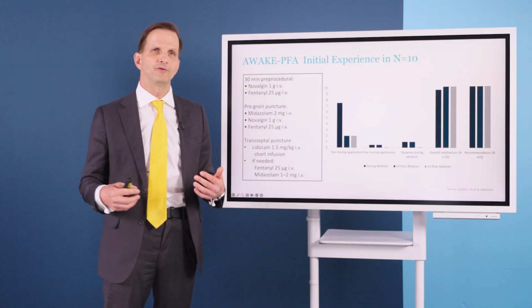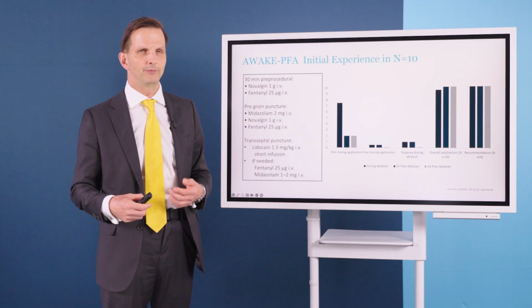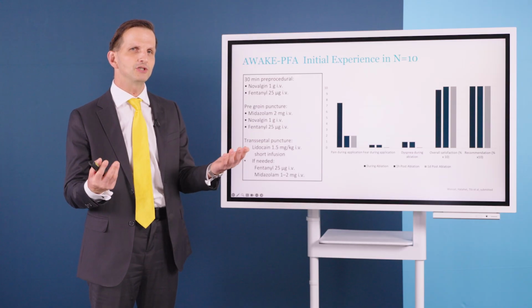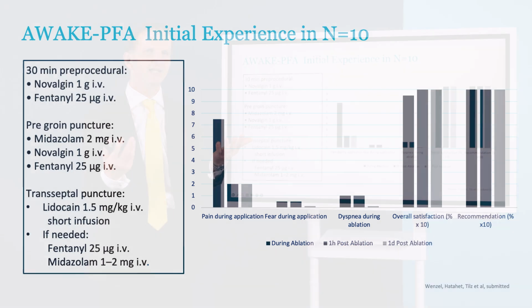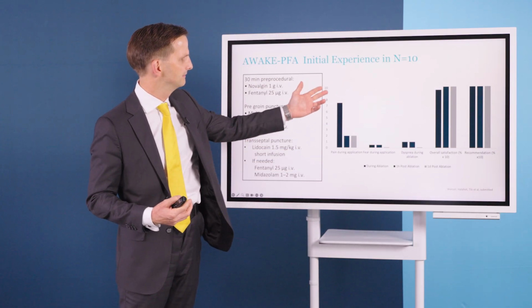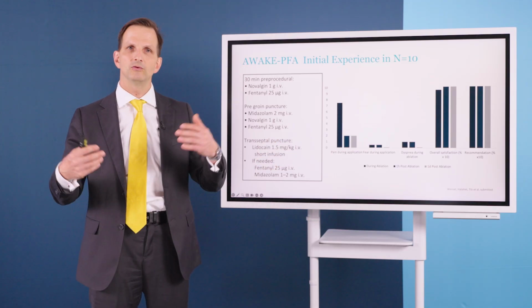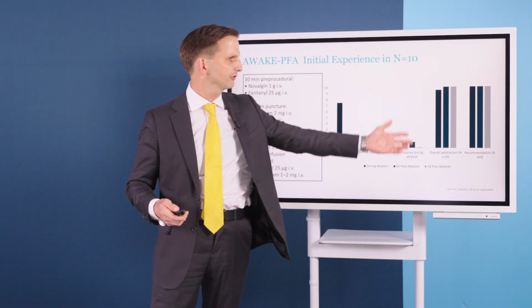We started to perform PFA procedures using the awake protocol, which means that the patient remains awake. You can continuously speak to the patient during the procedure. We have a standardized protocol for all these procedures. And it's a very new experience for us because what the patients tell is that they feel the pain. They say it's like a 7 out of 10 immediately after the application. However, they don't care about the pain. They're not afraid, and they're very happy and recommend it.